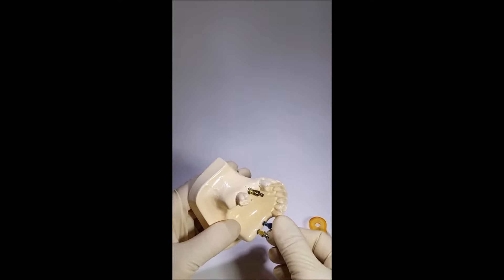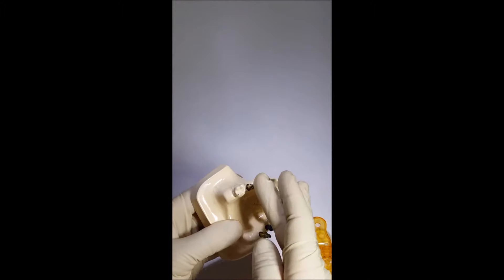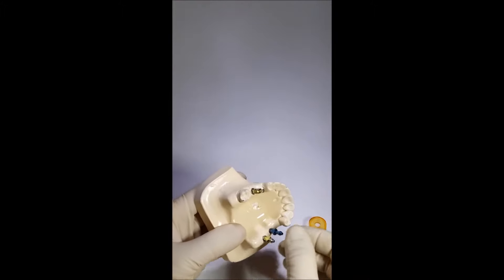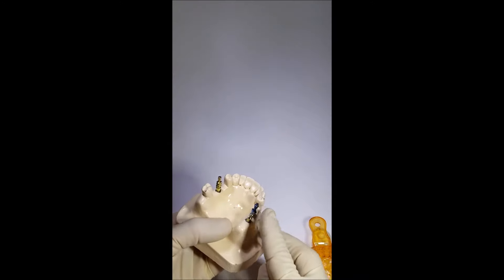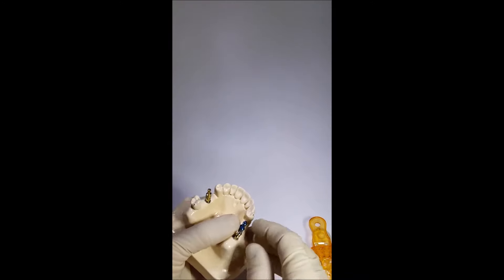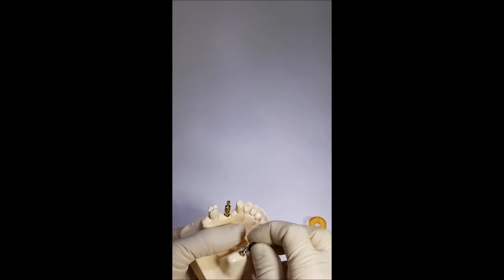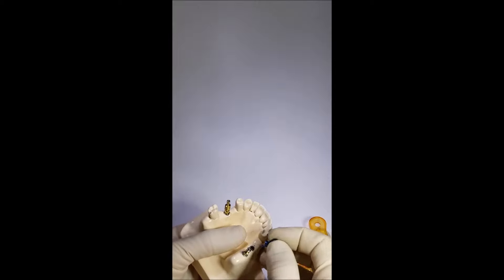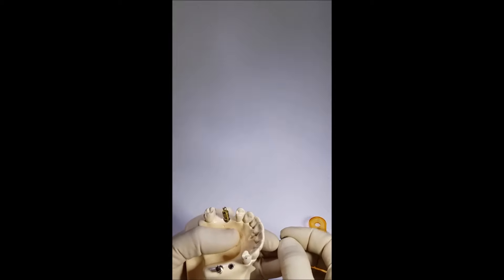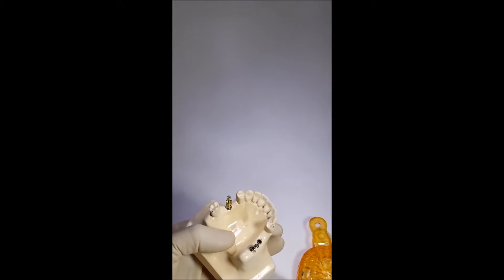The procedure works as follows: you install the transfer in the implant in the oral cavity, apply correctional paste, and put an impression tray with impression paste. Then you wait until it is hardened completely and remove the tray. The transfer remains in the impression tray. A denser impression paste should be used so that the transfer is properly fixed in the impression paste and remains in the tray, not in the oral cavity.